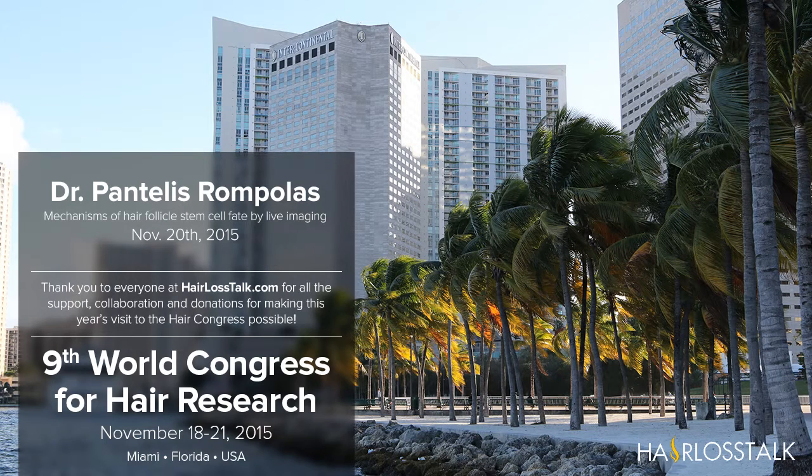And this is the mouse. Here, the photoactivatable reporter, which in this case is a photoactivatable mCherry, is fused to H2B. And so in the normal state, this reporter does not fluoresce, but by scanning a region with an activating wavelength, we can activate this reporter. The activation is irreversible, and so now it functions as a regular fluorescent mCherry.